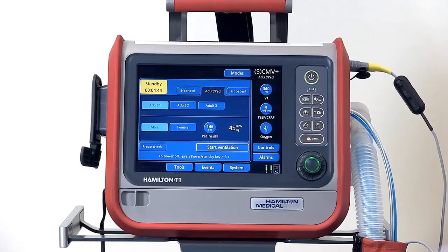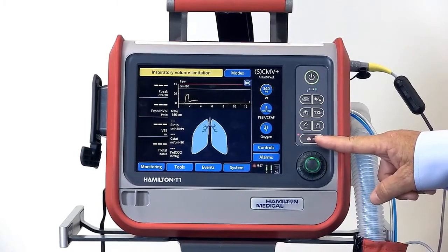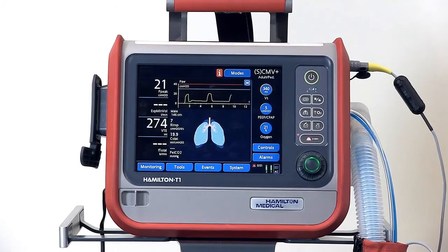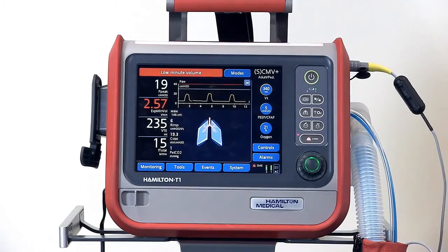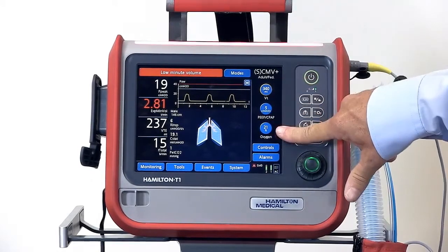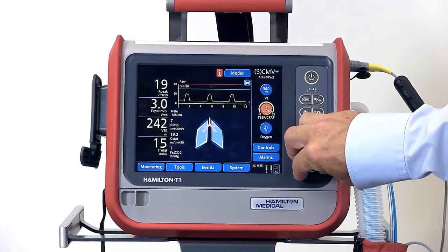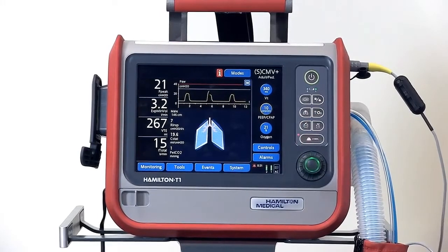To start the ventilator, simply press start ventilation on the screen. The ventilator will automatically start with the alarm silence activated, and after a couple of moments you'll see your monitored values appear. To make another setting change while ventilating, your basic ventilator settings are here on the right — just touch the basic ventilator setting you would like to change and confirm.